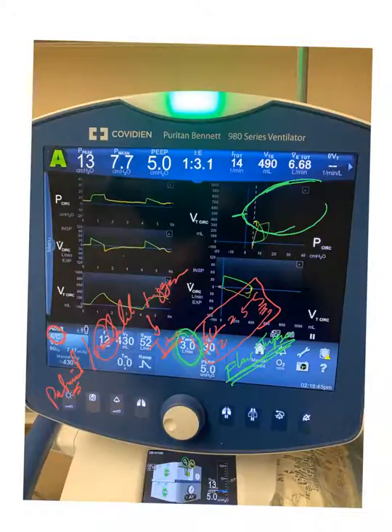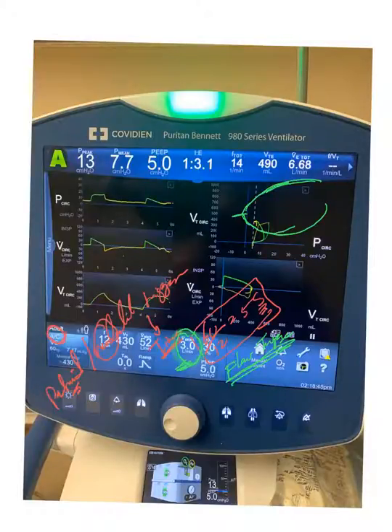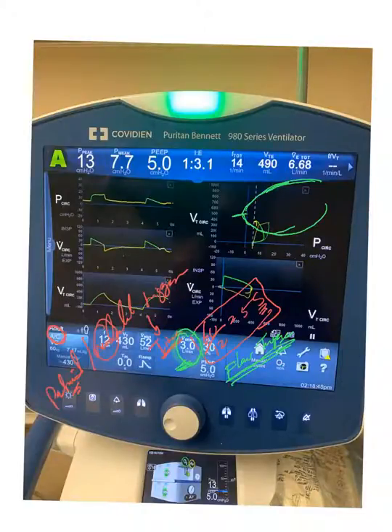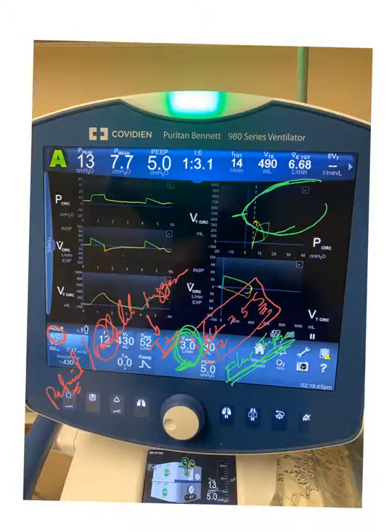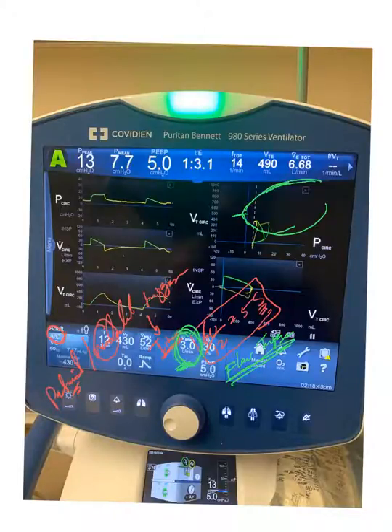So the trigger here is a flow trigger — it's a hybrid of assist and control breath, a hybrid of patient and ventilator triggers. The assist breath, the patient-triggered breath, is flow triggered on this ventilator. Of course, you can simply press a button and change this to a pressure trigger.